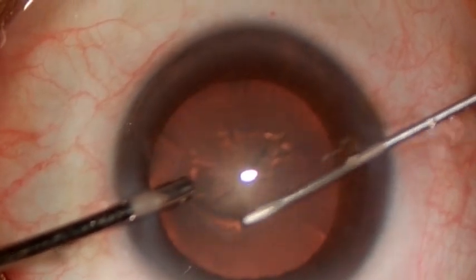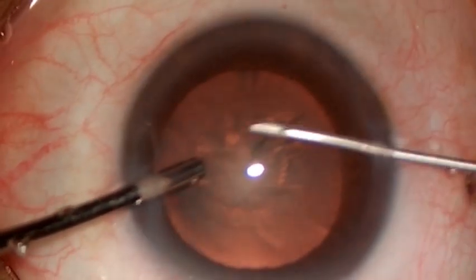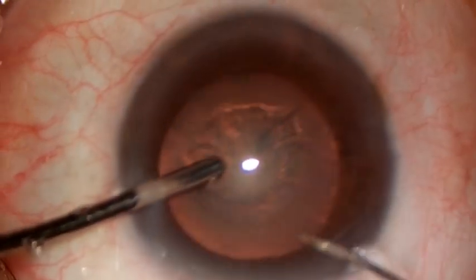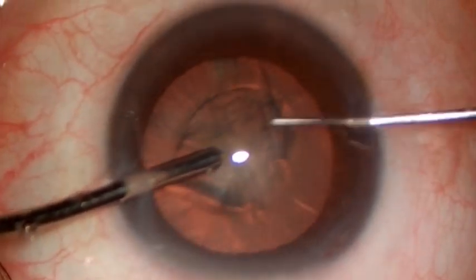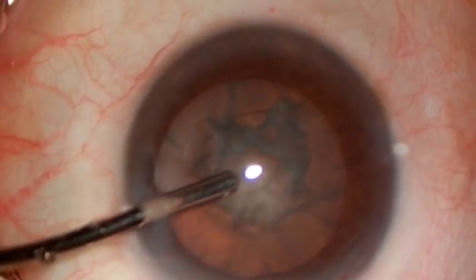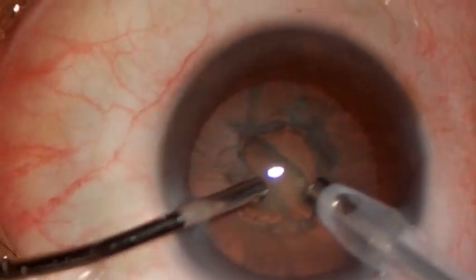In all our videos, we have edited the phacoemulsification part as it is not relevant to our study. But the part of doing CCC and intraocular lens implantation is unedited. But it is fastened 3 times to save some time.